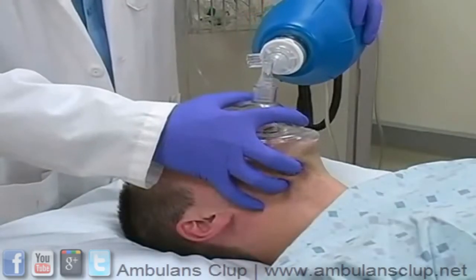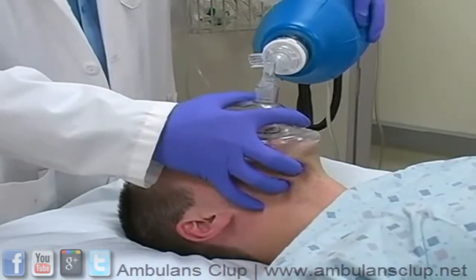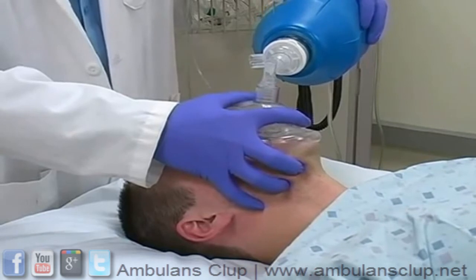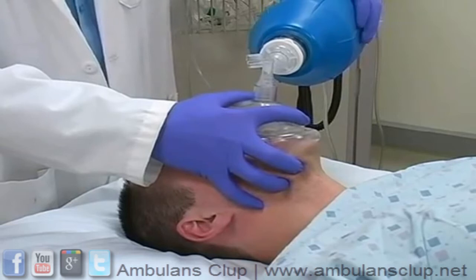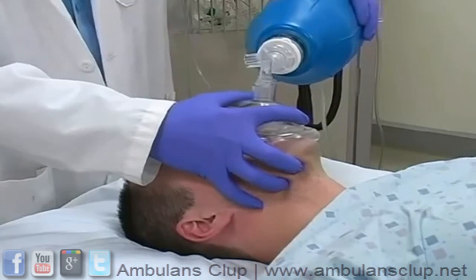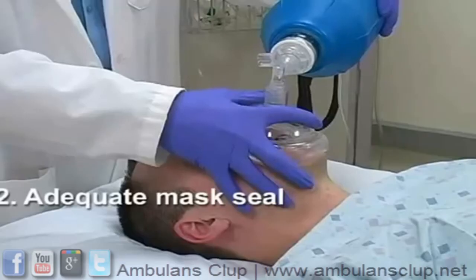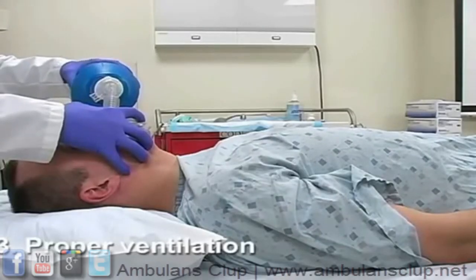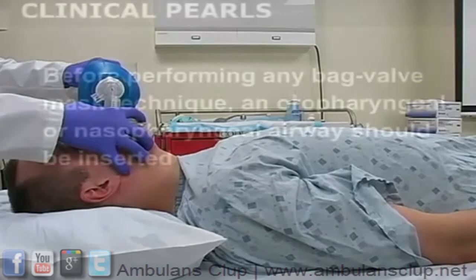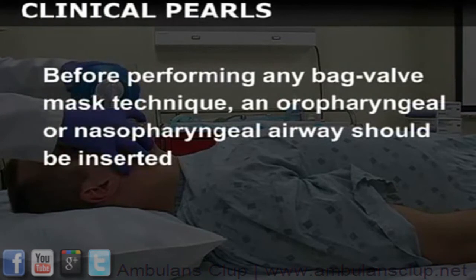Bag mask ventilation is a critical airway management skill, yet one of the most difficult to perform. Successful bag mask ventilation depends on 3 things: a patent airway, an adequate mask seal, and proper ventilation. Before performing any of the following bag mask techniques, an oropharyngeal or nasopharyngeal airway should be inserted.